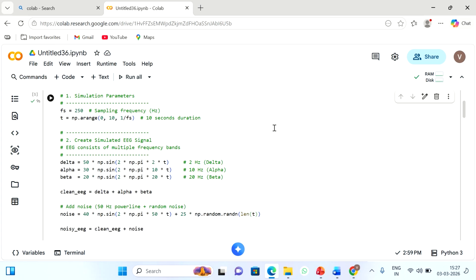So as usual, the random noise will be taken, and overall we are introducing the RAND and LENGTH functions for the full process, because sampling we are definitely going to apply on the signal. Why are we applying sampling? We are using the digital signal.